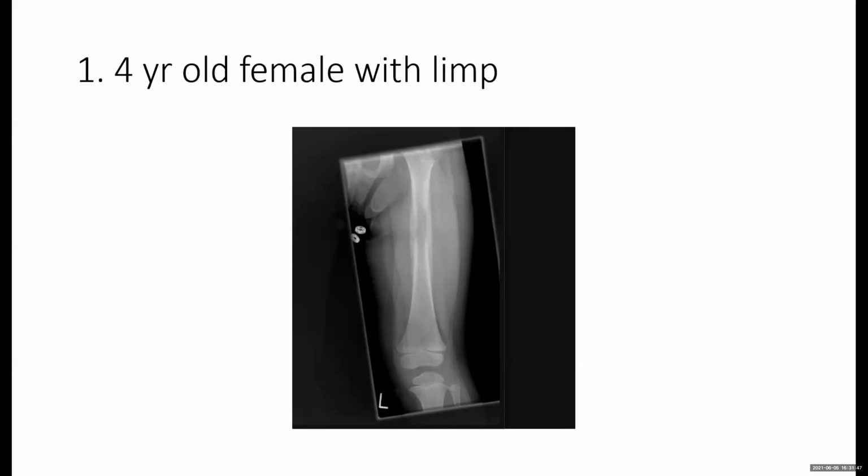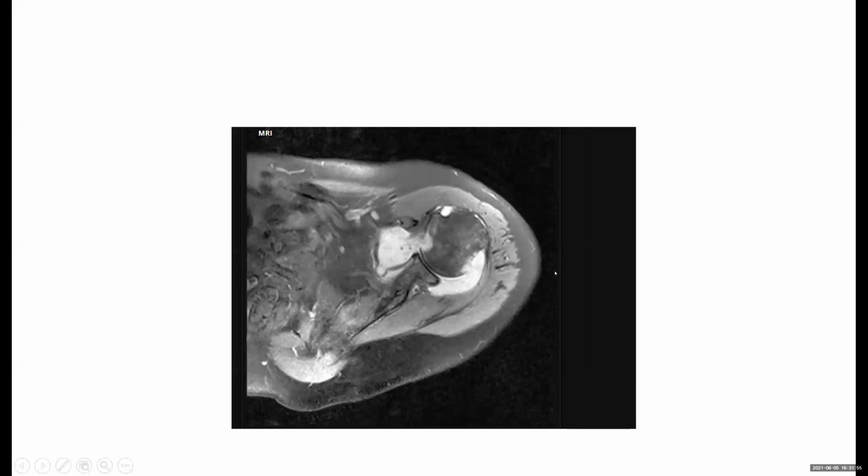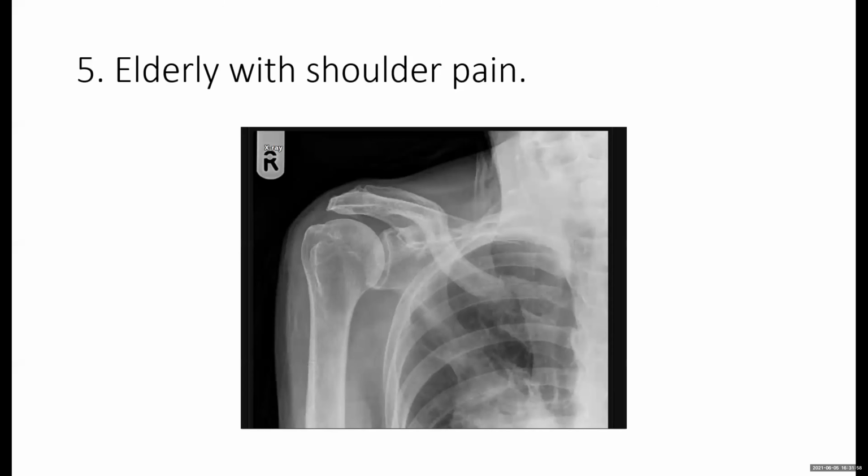And regarding the last case, the shoulder case, once we say that there is a suspected chest lesion, we always have to say out the next step. The next step is chest X-ray. Of course, it's something which is understood, but the examiner would like to hear the words, because this is a shoulder X-ray. These are the only things which I wanted to say.